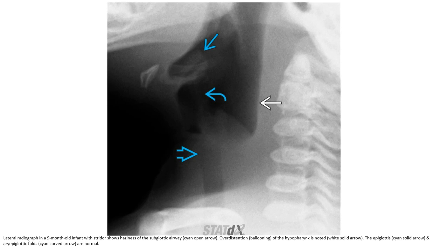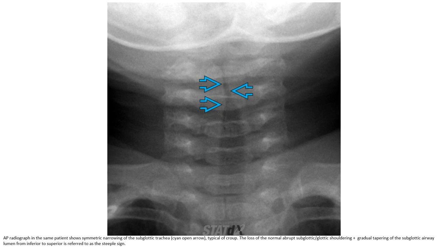This is the case of a nine-month-old infant. On the lateral view, narrowing of the subglottic area and overdistension of the hypopharynx is noted. The epiglottis and aryepiglottic folds appear normal. On the AP radiograph in the same patient, symmetric narrowing of the subglottic trachea is seen, with loss of the normal subglottic shouldering — referred to as the steeple sign.